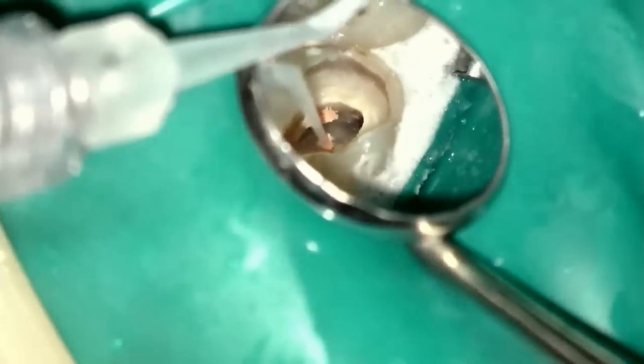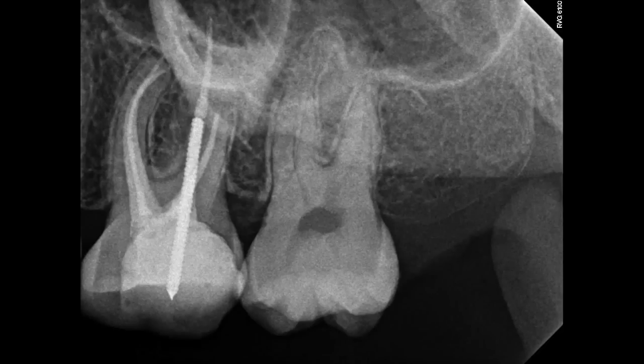We're going to go ahead and make some post base here. Rinse that all out, fit a post. I've already etched, primed, and bonded to the structure, and I'm cementing the post down. Once the post is cemented, I proceed with building up. I like to use this super white endo sequence buildup material — it flows really well, cuts really well, and sets up pretty quickly. This is something I've been using for the last few months and I really like the results. Once we clean off the excess, light-cure this, prep it away, and take the rubber dam off, we have a look at the final x-ray, which looks pretty decent.